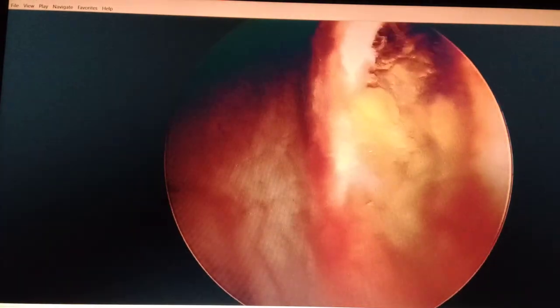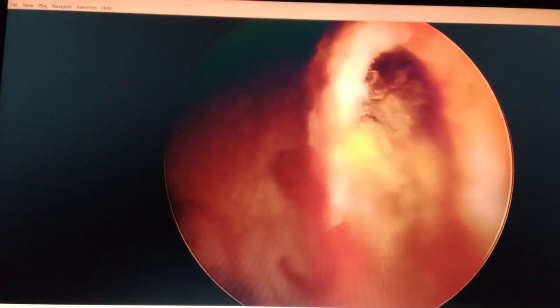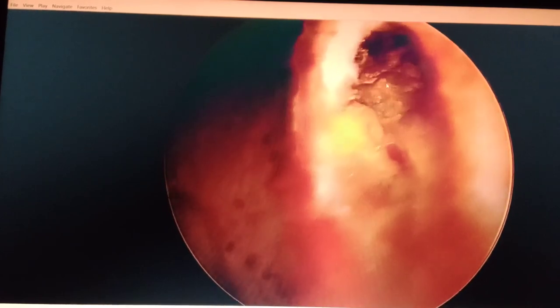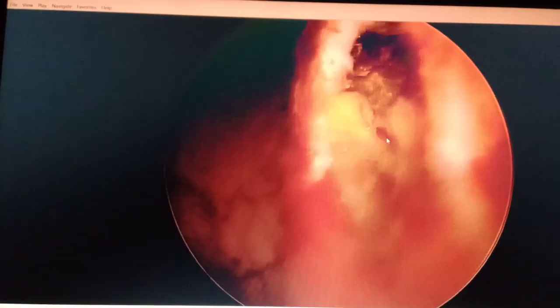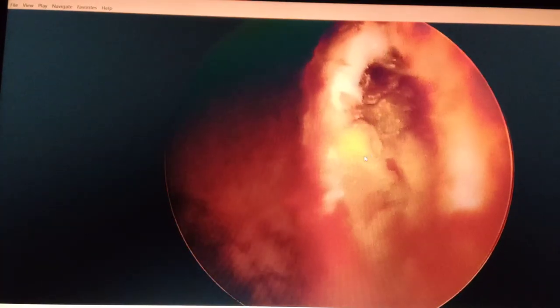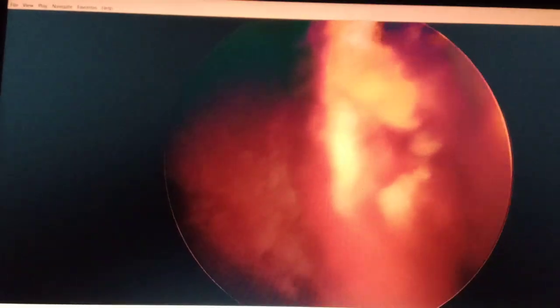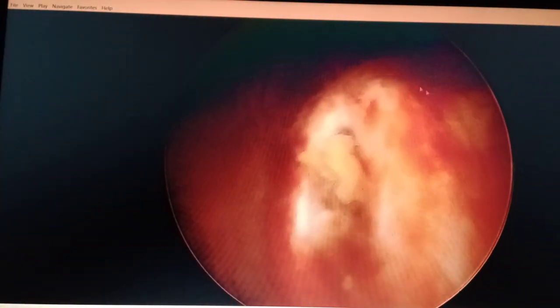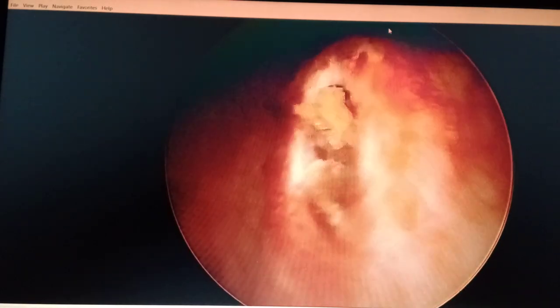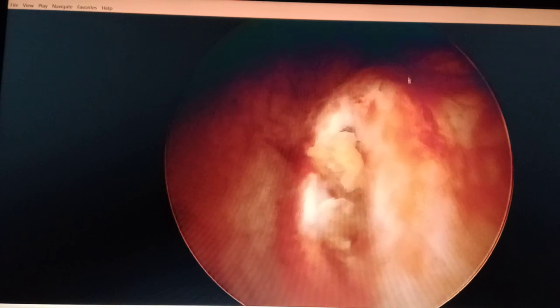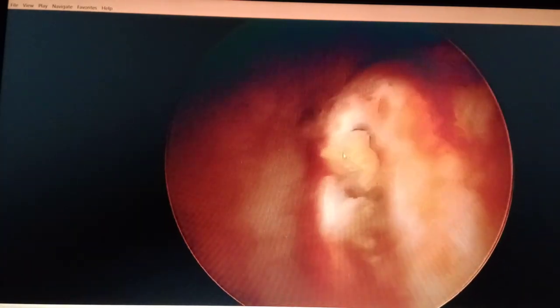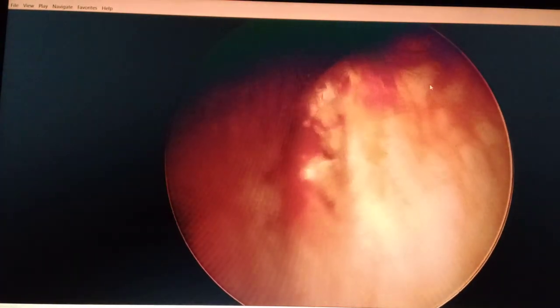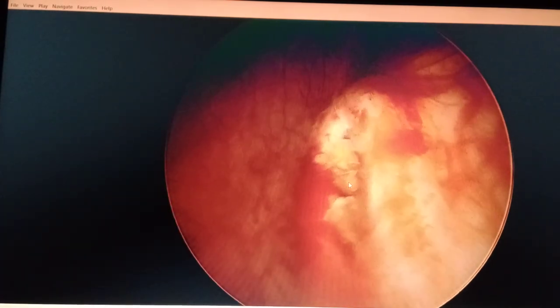Just focusing over the left ureterovesical opening at the junction. Now here you can see the ureteric opening and these are the parts of the fragmented stone that was projecting inside the bladder lumen. Now you can see this is again the projected part of the junction wall. It means it is having a larger part of the stone lying inside this area, but we can only access this part when we have some space here.